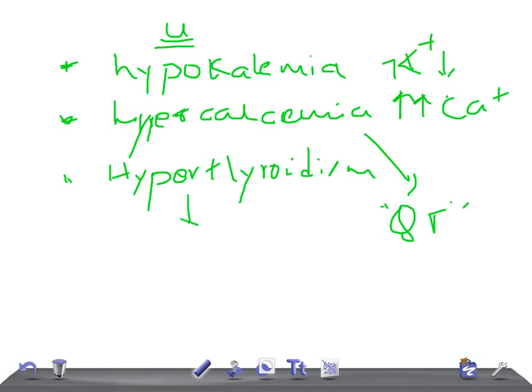Regarding hyperthyroidism, it's not due to the hyperthyroidism itself but due to the tachycardia. Prominent U-waves in association with tachycardia should make you think of hyperthyroidism. Check the levels of T3, T4, and TSH.